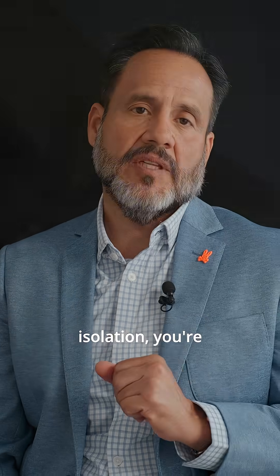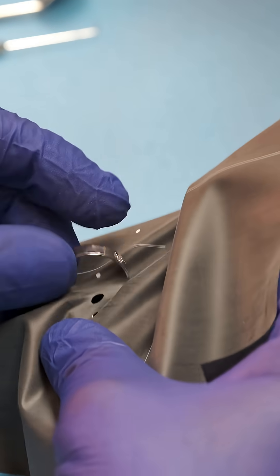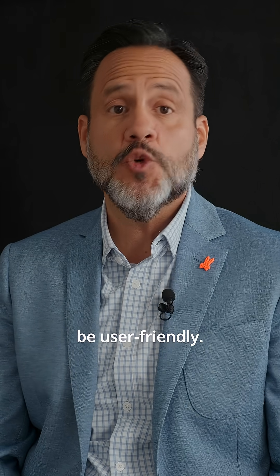If you're not using rubber dam isolation, you're compromising results. In Chapter 2 of my new book, I will walk you and your team through a step-by-step protocol that has proven to be user-friendly.